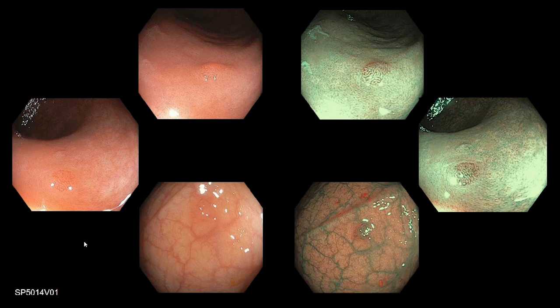So we can see some beautiful images, as you, I'm sure, have seen in some of your practices, and we'll go over tonight some of the features that we're actually seeing as we're looking here in white light and here in narrowband imaging light for some of these polyps, small and larger.